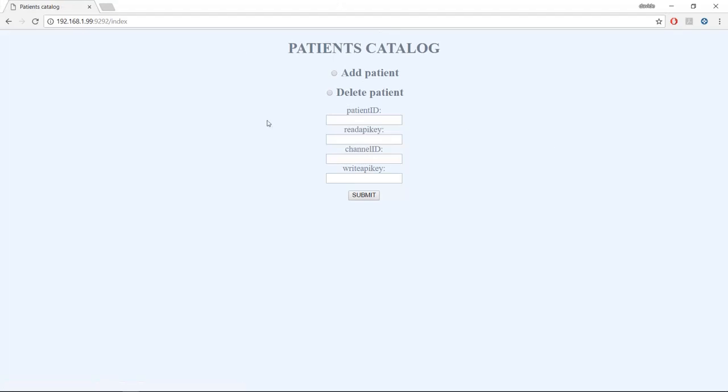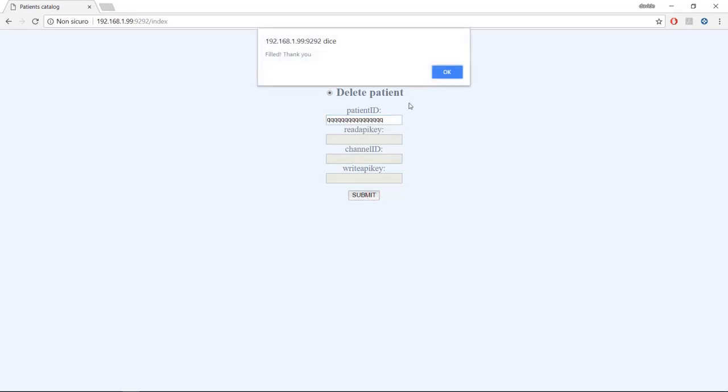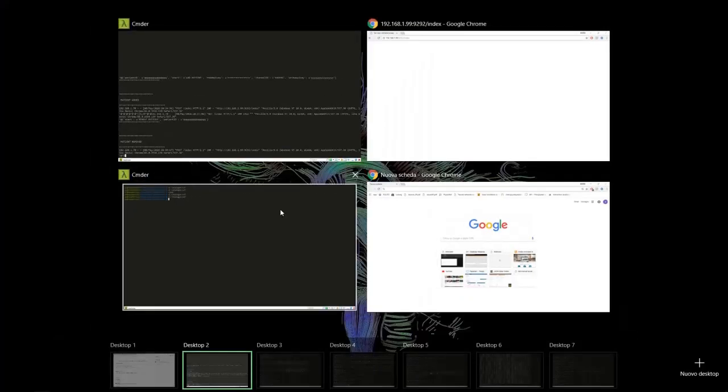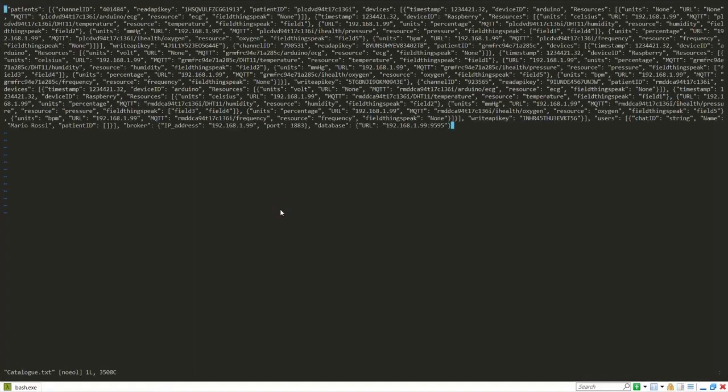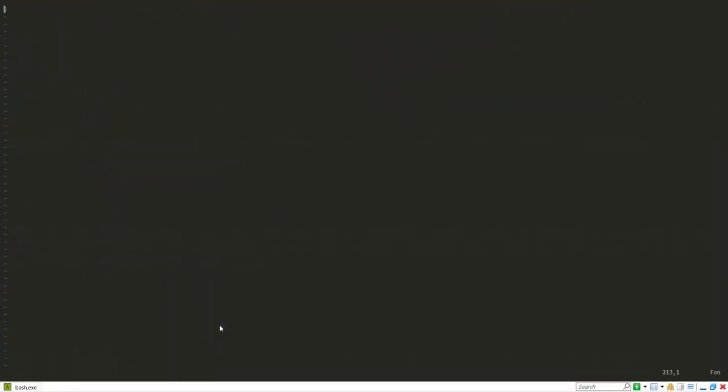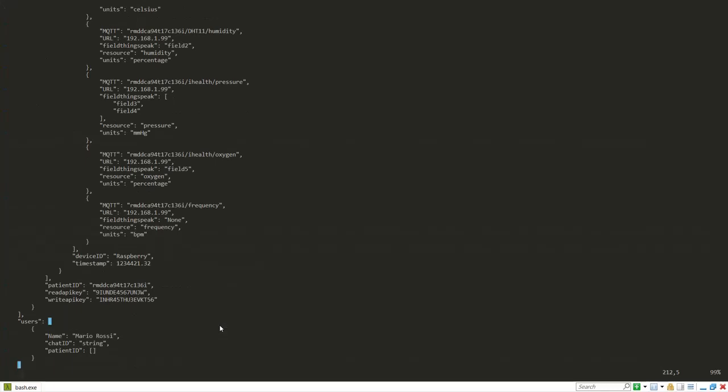Now we will see how to delete the patient we added. So, if we want to delete the patient, we only have to insert the patient ID. Now we will check if the patient has been removed. We have patient removed, and if we go to the catalog, we can see that we don't have QQQQ anymore.